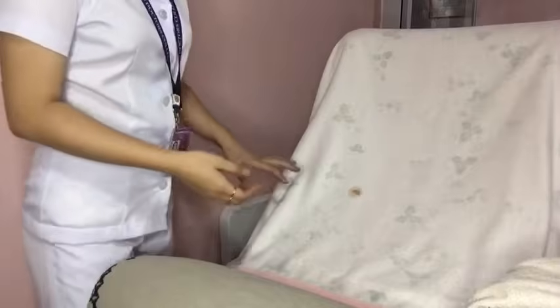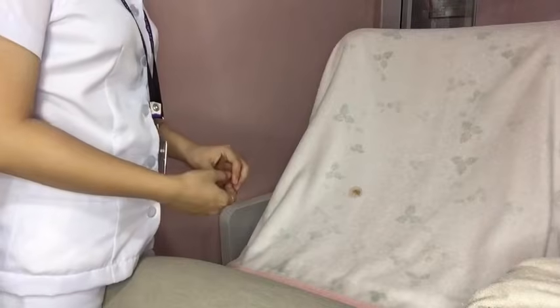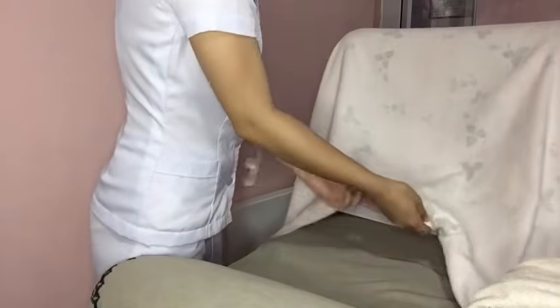Now let's drape the patient, exposing only the area used. Embarrassment and chilliness can cause the patient to become tense, and tension can interfere with easy introduction of the catheter and with directing light for visualization of the genitalia. So now, let's drape the patient.